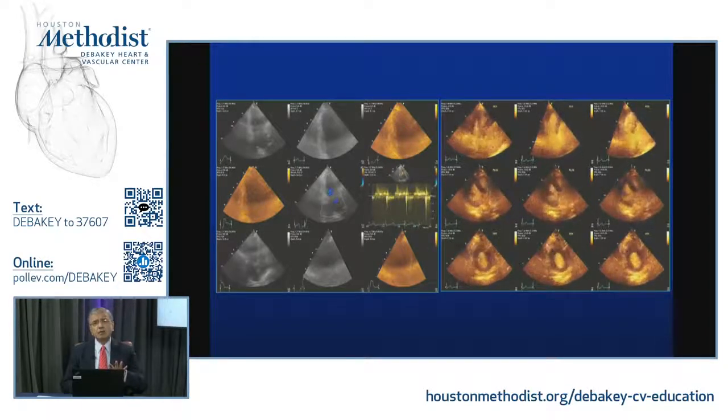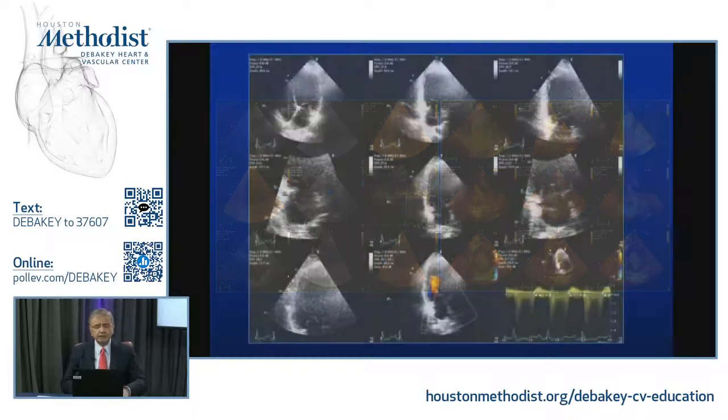And I think we should be the stewards of quality. We should all be the directors, and also the laboratory sonographers as well as physicians interpreting, the stewards of giving the best interpretation, the best data from the studies that we do. Therefore, appropriate use of contrast echo should be part of every laboratory. The good thing is that IAC, the accreditation body, has mandated that laboratories have protocols for how to use contrast in their laboratories, and all the processes that are needed. So I think this is very important.